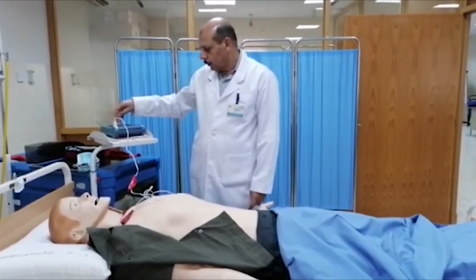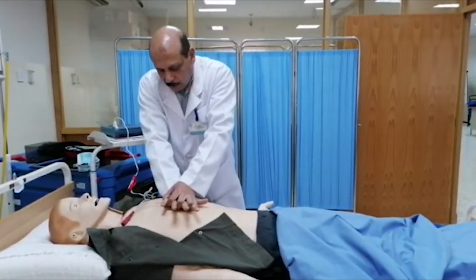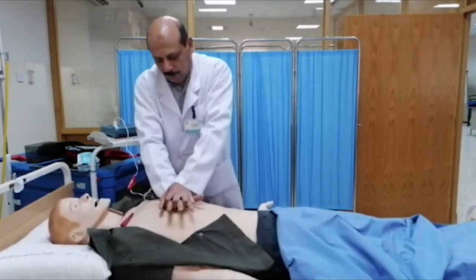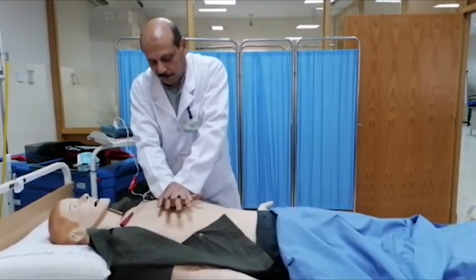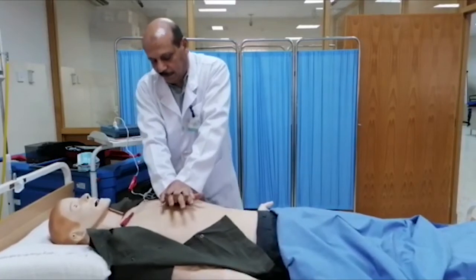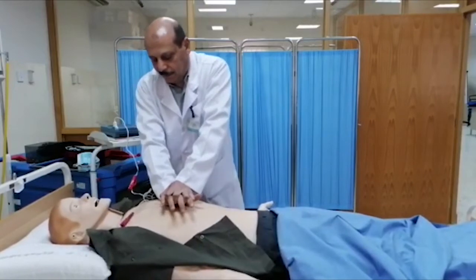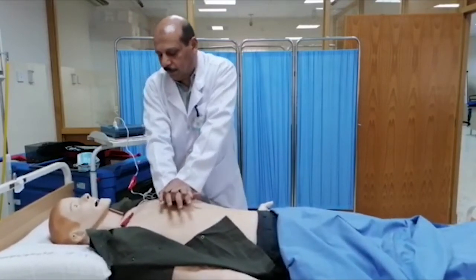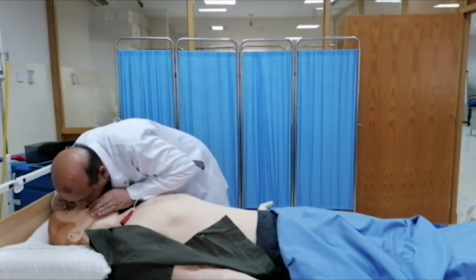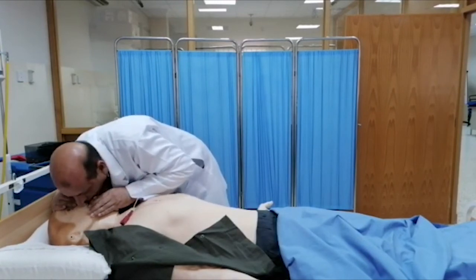Place the heel of one hand in the center of the chest between the nipples. Place your other hand on top of them first. Push the chest down firmly five centimeters. Keep time with the beat. Tilt head, lift chin, and give two full breaths. Breathe. Breathe. Continue.